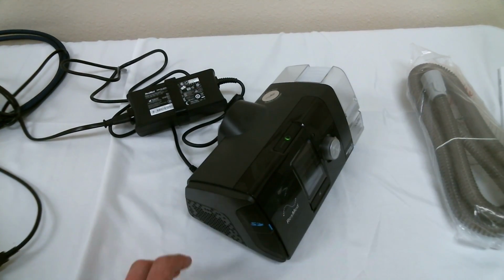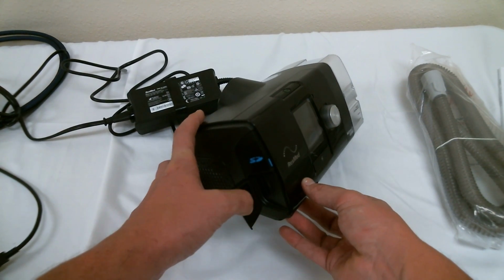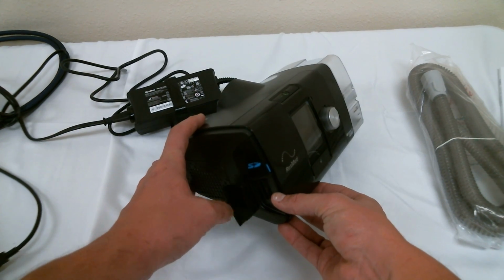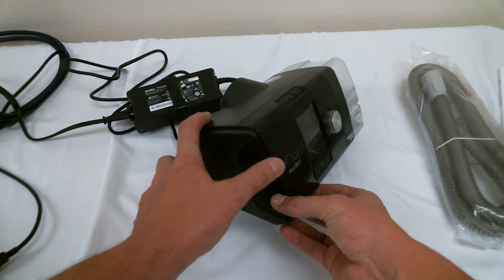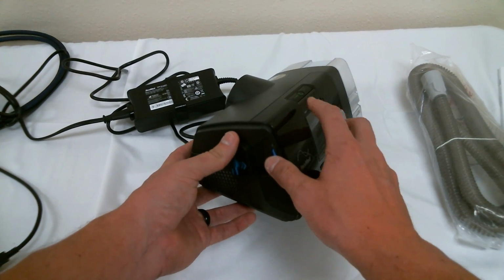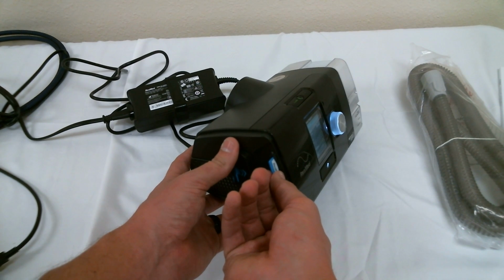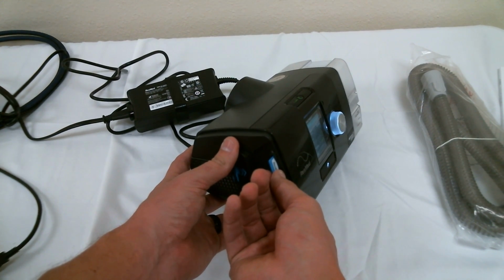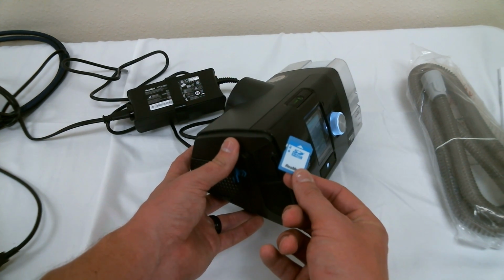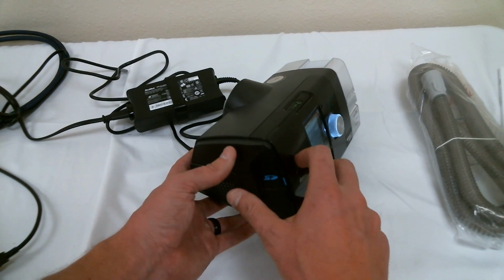On the left side of your machine, you have a flap at the bottom left. This is an accessory connection. At the top left, you have an SD card. This card may be required on follow-up visits to your doctor, so remember to take it along by pressing to release and removing it. Once you return, replace the card and cover it.